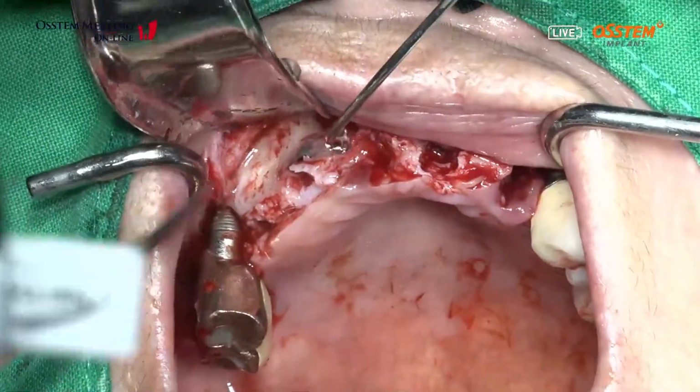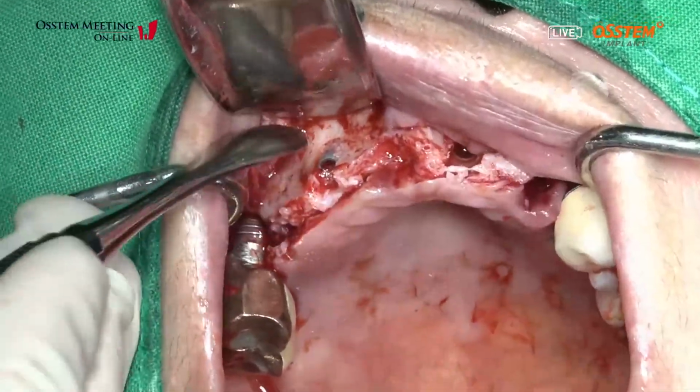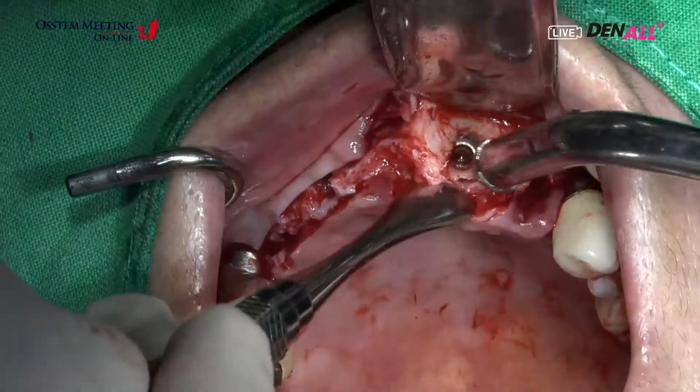As I expected, in the canine area, the implant was exposed here, and then in the central incisor area.